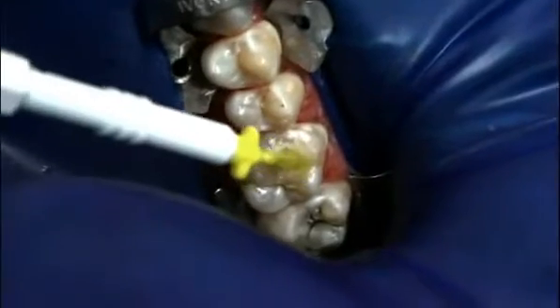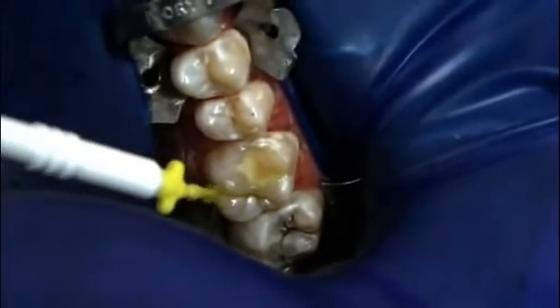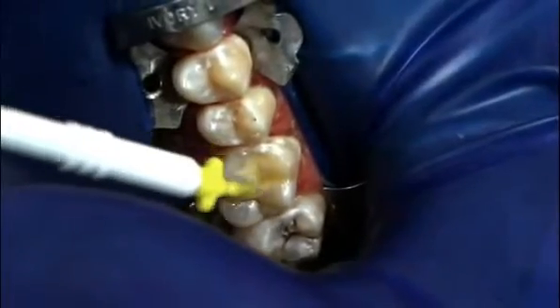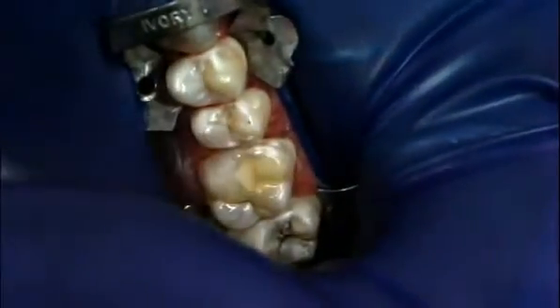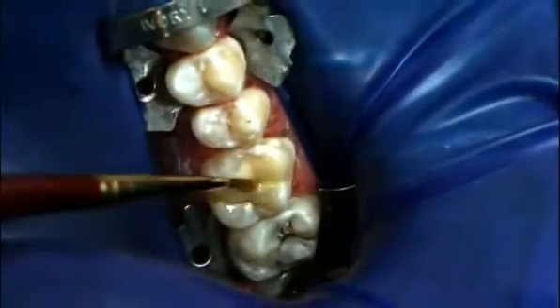A thin layer of self-adhesive G-Coat Plus by GC America is applied to all exposed glass ionomer surfaces and to adjacent tooth surfaces, including the distal lingual fissure, with a sable brush or a micro-tip applicator, and light cured for 20 seconds.